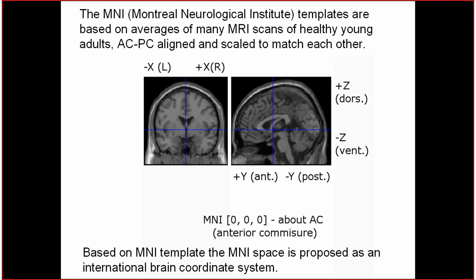There are three coordinates for every point of your image. The first coordinate, X, is the left-right direction: on the left it is a negative value, on the right from the midline it is a positive value, and zero is in the middle. The Y coordinate can also be positive and negative, and it represents the sagittal direction.